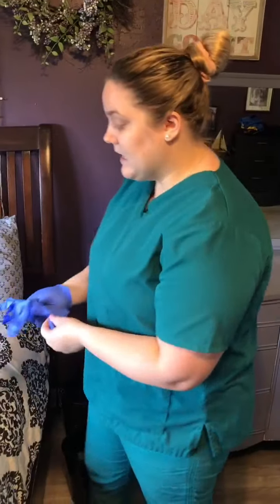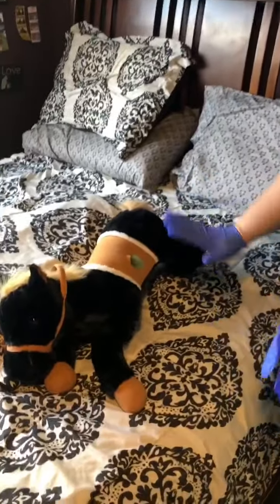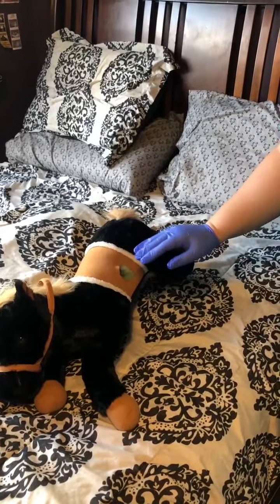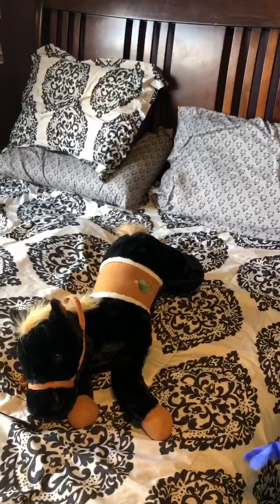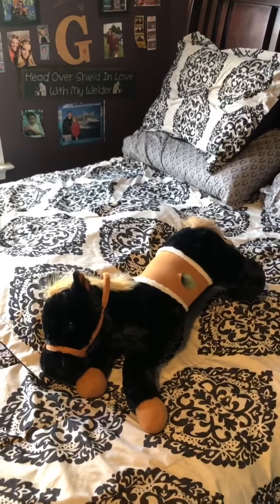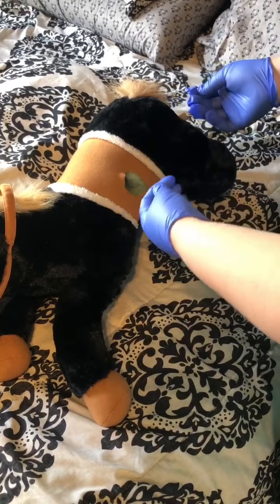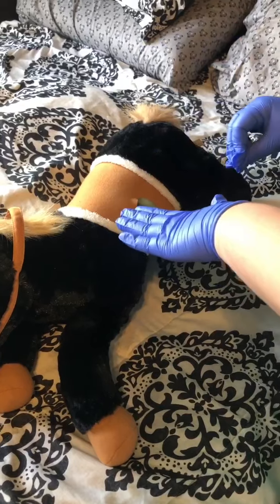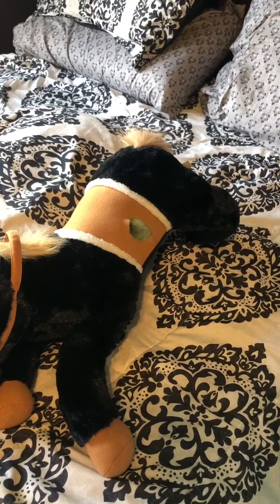pads and gauze inside. So right now, just in the pretend world, he does have the ABD pad and the 4x4s inside. So the first thing I would do is I would hold the ABD pad. If there was tapes, that way the skin wouldn't be irritated, I would remove that, and then I would count each of the 4 gauze pads. So then after I removed all of that, I would note that I removed the ABD pad and 4 4x4s.